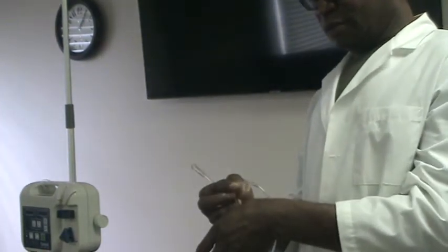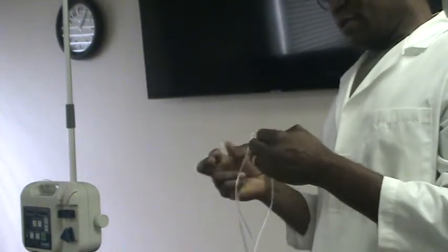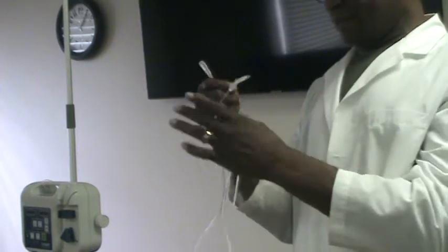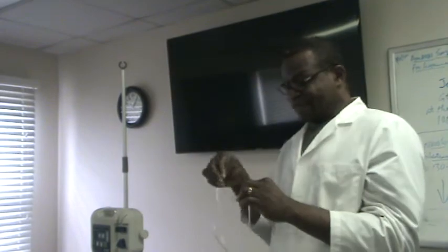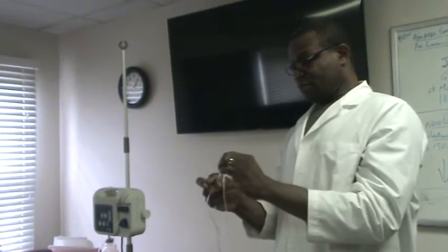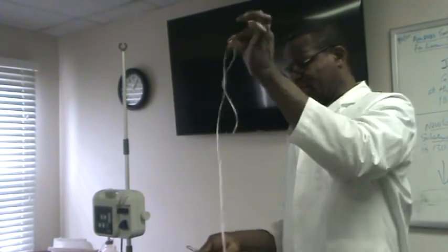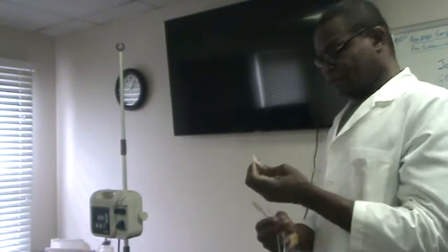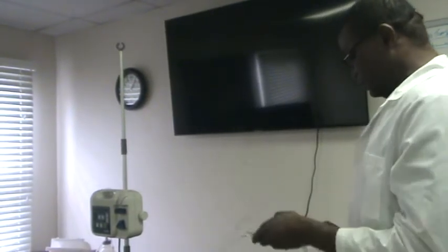You can check it, because sometimes you walk around and it's been irritating their ears, and then they have it like this. That means they're not getting oxygen. Or they sneeze into the hole, and it blocks the flow of the oxygen. So you can either rinse it or change the tubing to a new tubing if that's blocked. Alright, so oxygen is pretty easy to do.